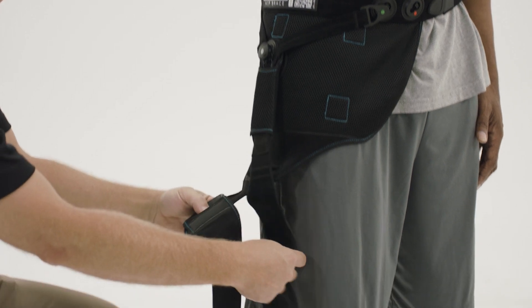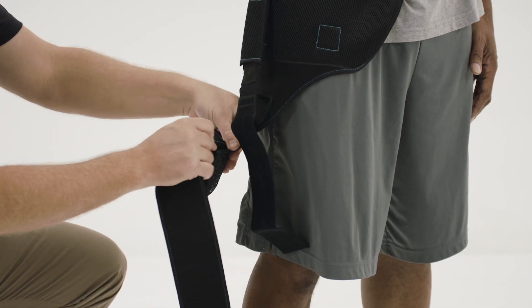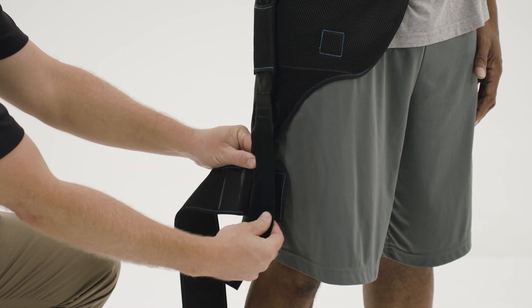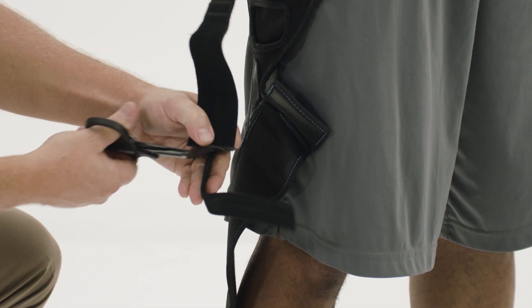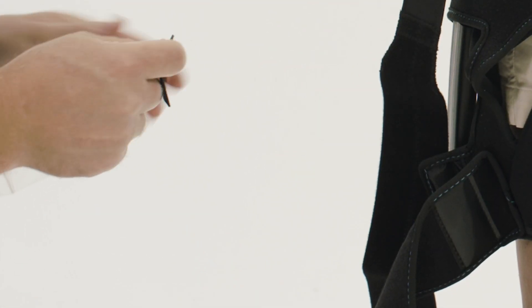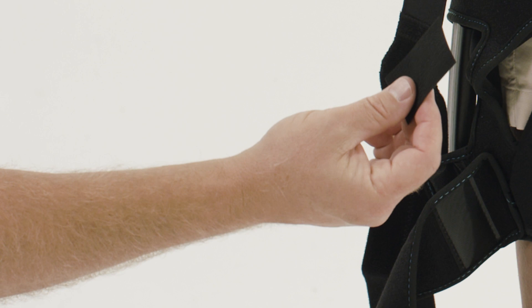Open the lower thigh strap and, if present, remove the rotation strap from the velcro. Hold the Y-strap end to the front-most velcro in the T-strap and trim the strap end. Remove the velcro strap holder from the accessory pack.